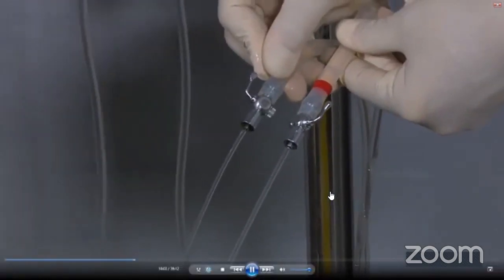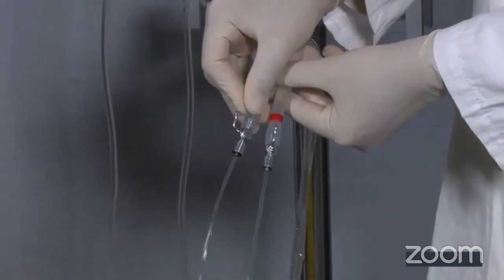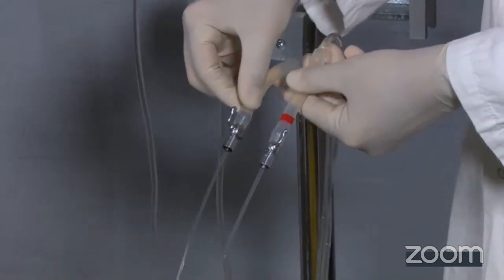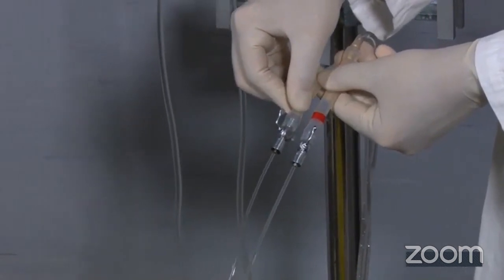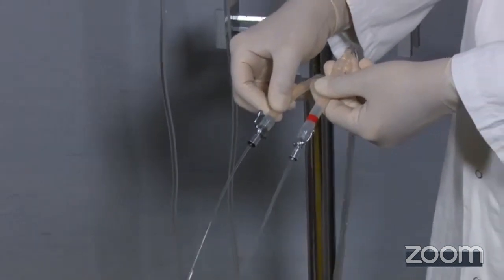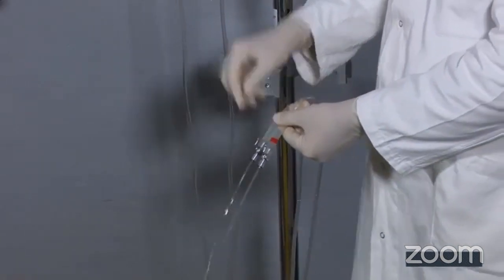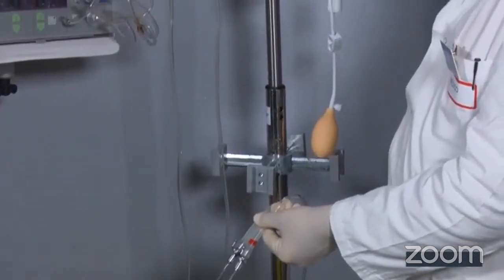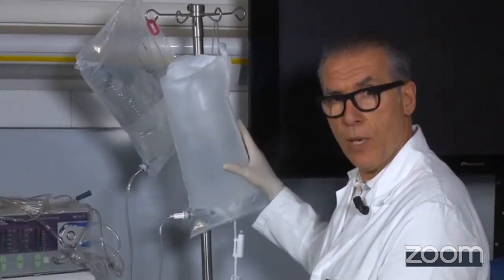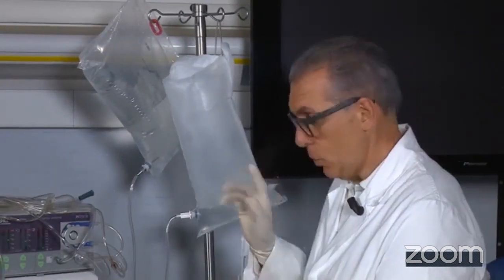You see, I have the same silicone tubes, but on this one, we have only the gravity pressure, and on the red one, we have an extra force generated by the compressive cuff. So I have much more flow here, that will generate a different pressure inside the uterine cavity. And again, as soon as the liquid decreases inside the sac, there will be less liquid, less compression acting on the sac, and therefore less flow. So you see, that's the difference.